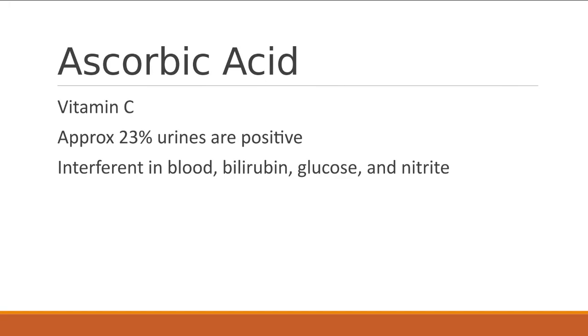You can suspect it whenever red blood cells are present, or if you have ketones positive and glucose negative. Don't worry about that. But do worry about what it's an interference for.